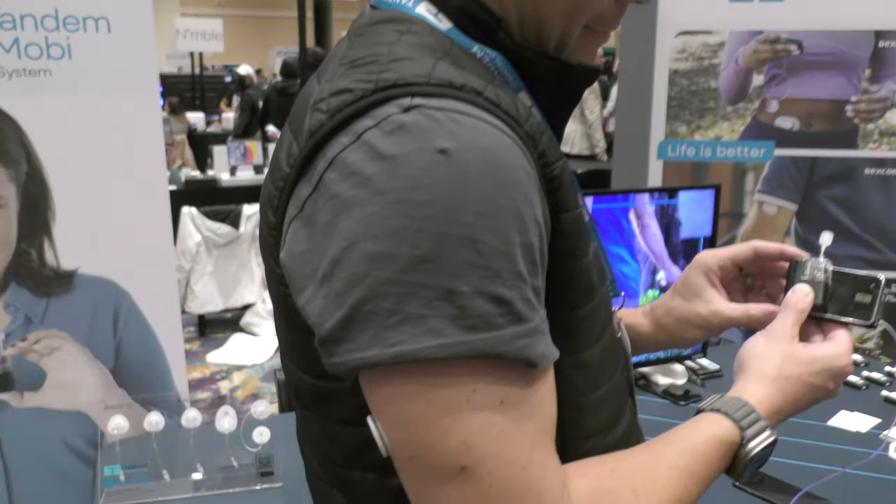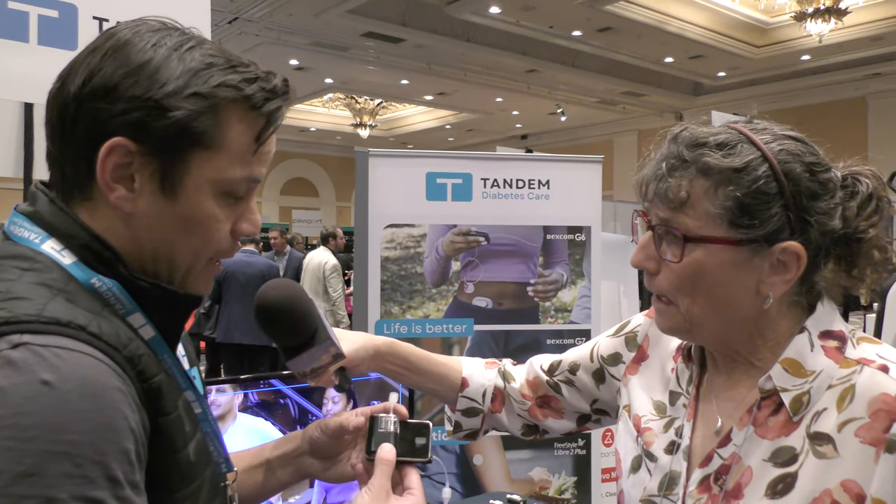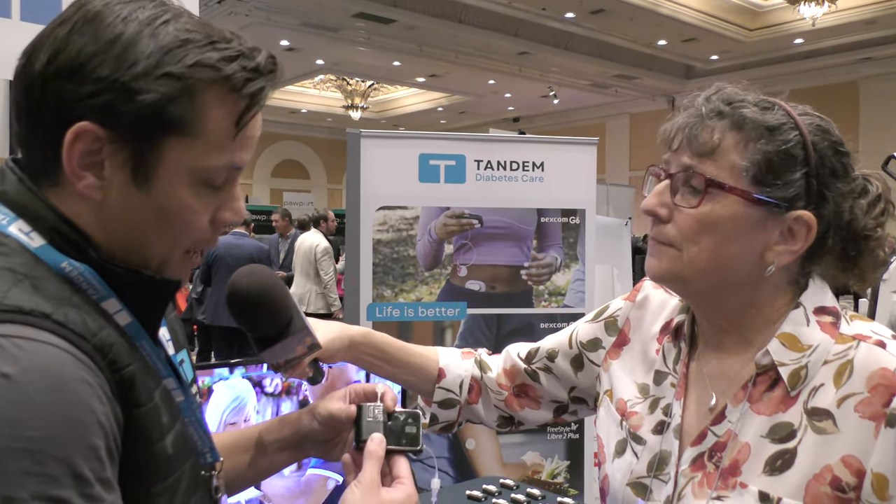Insulin is delivered every five minutes based on your CGM readings, and the Moby is much smaller than the T-slim X2. It has actually just recently been cleared by the FDA, and Tandem is in the process of releasing it to the public starting this year.